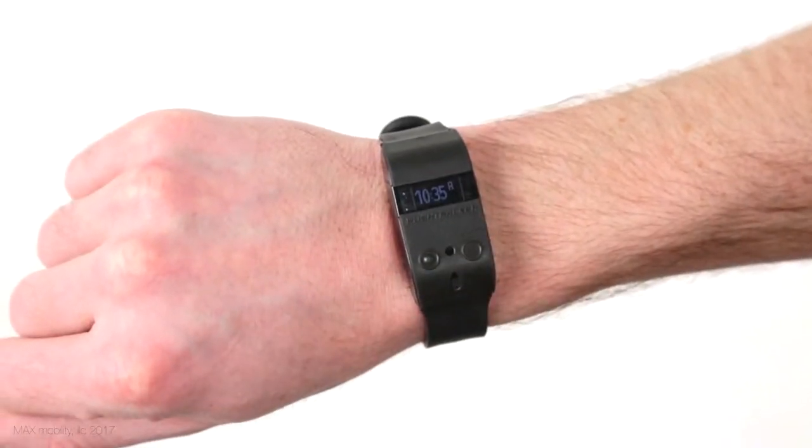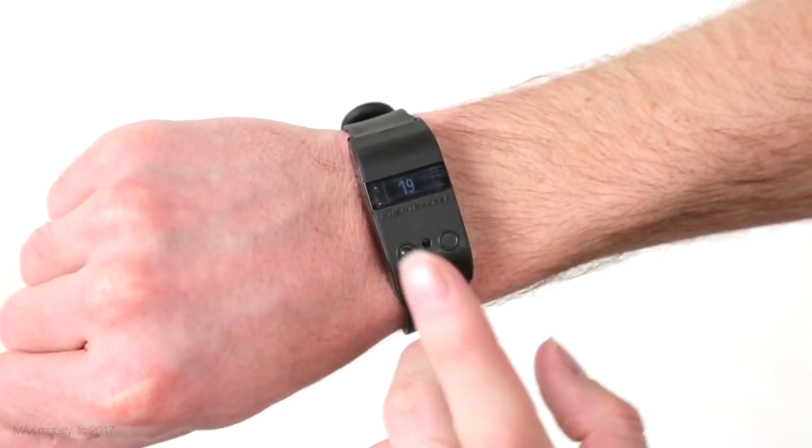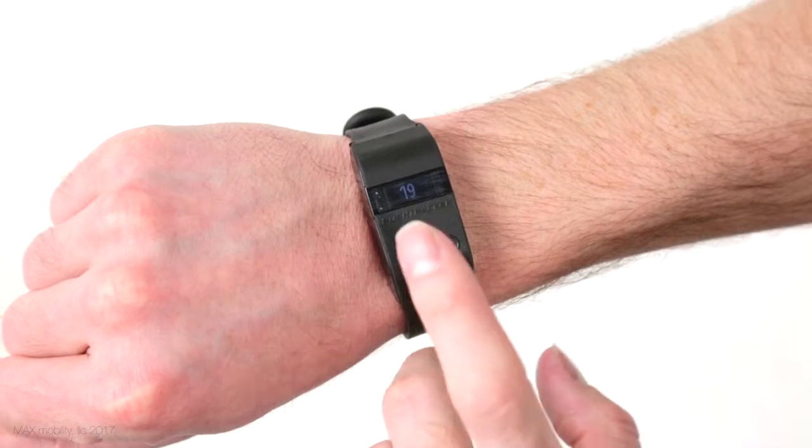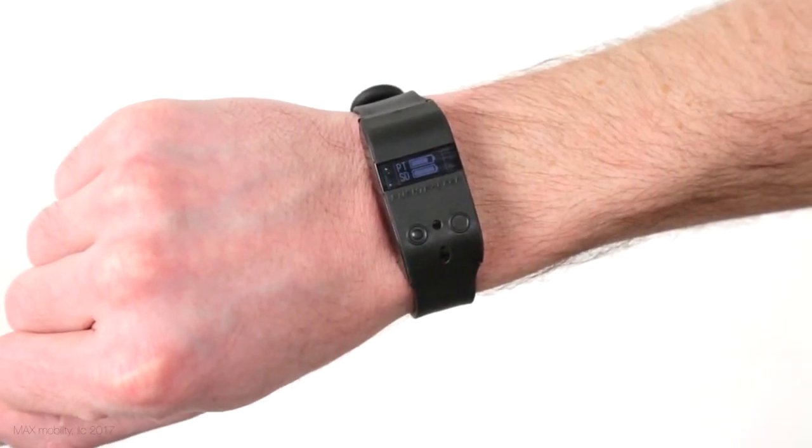You'll see that it first displays the current time in either 12 or 24-hour format, whichever you prefer, and select in the settings. Next, either another tap or waiting will cause the display to scroll to the second screen, showing the number of pushes the PushTracker has counted that you've done that current day. You'll then need to do another tap to scroll to the current PushTracker, or PT, battery level, along with the smart drive, SD, charge from the last time you were wirelessly connected.